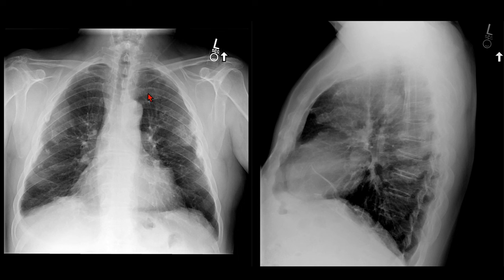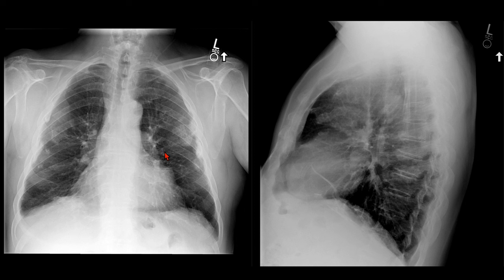Let me show you a case of calcified pleural plaques. On this radiograph, the first thing that jumps out to me are these angular, sort of scalloped opacities in the mid-lungs.